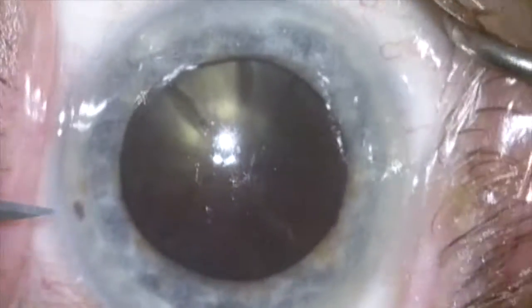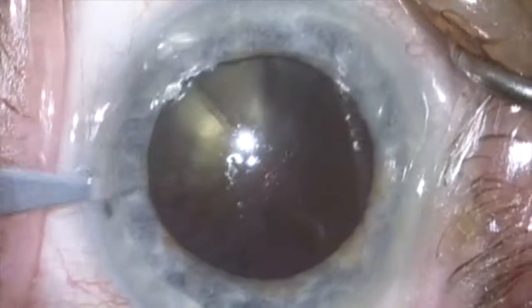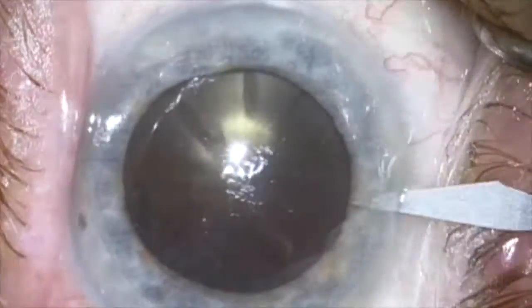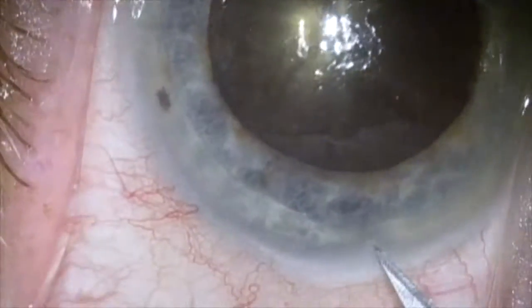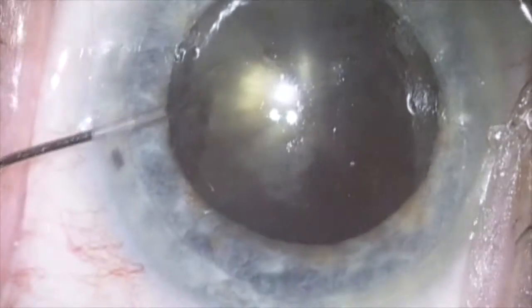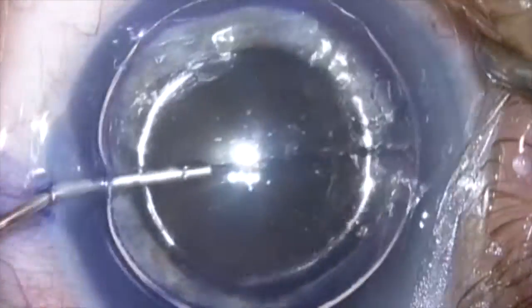This is a patient with an extremely dense, cold black hand motion cataract referred in for cataract surgery. She is 95 years old and the other eye has an anterior chamber lens with glaucoma after cataract surgery.